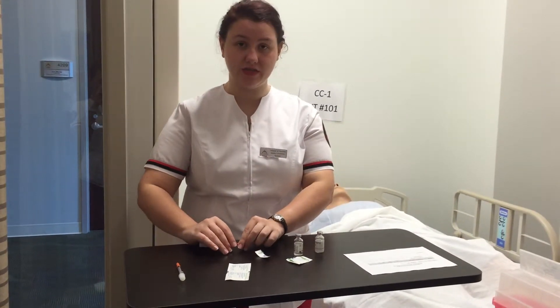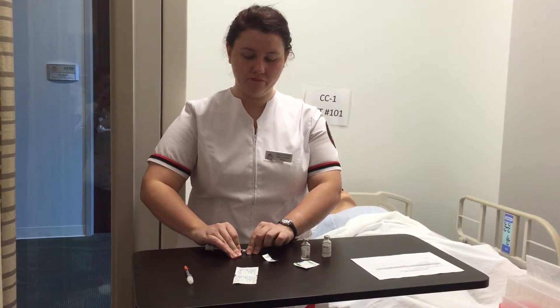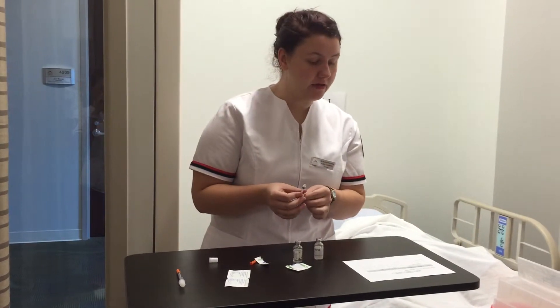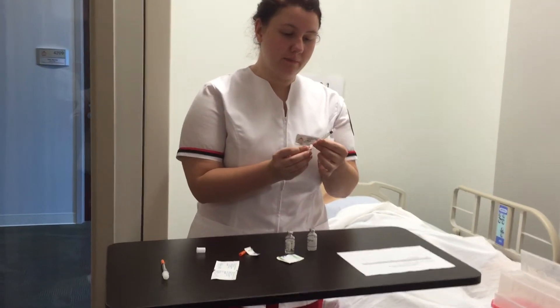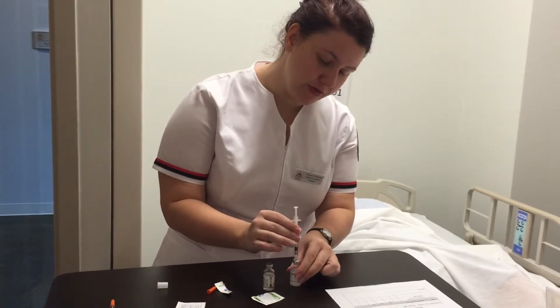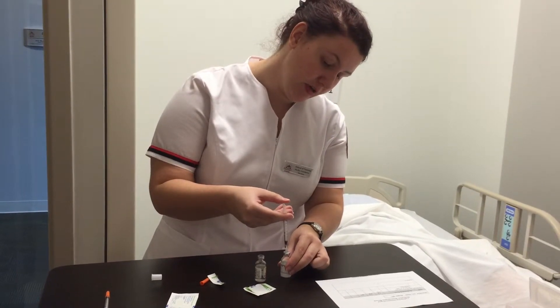I'm going to take my syringe and safely uncap it. With my NPH I have 20 units, so I'm going to pull back 20 units of air. Now I'm going to put that 20 units of air into the NPH vial, being careful not to touch the medication with the needle.